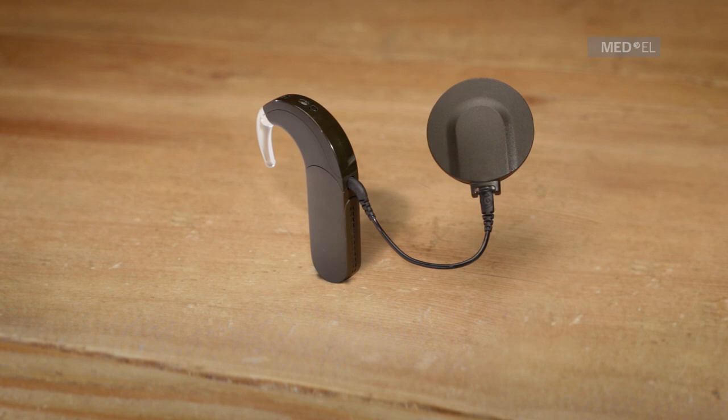If the optional status light has been activated, a short green light will blink every 3.5 seconds to indicate that Sonnet is initialized and working. Continuous red blinks indicate the batteries are empty and should be replaced. A continuous red light indicates that either minimum or maximum volume or microphone sensitivity has been reached.